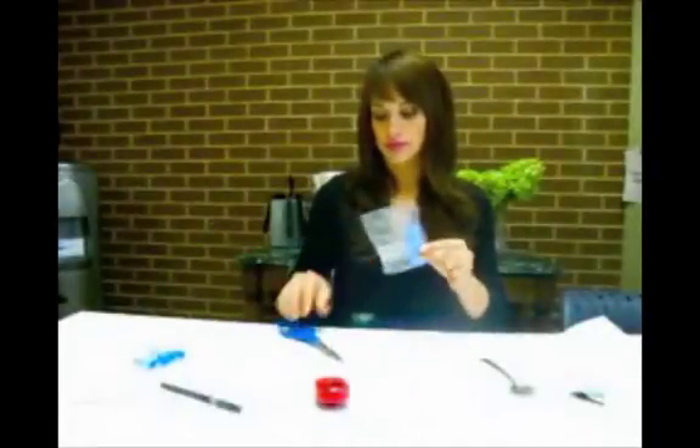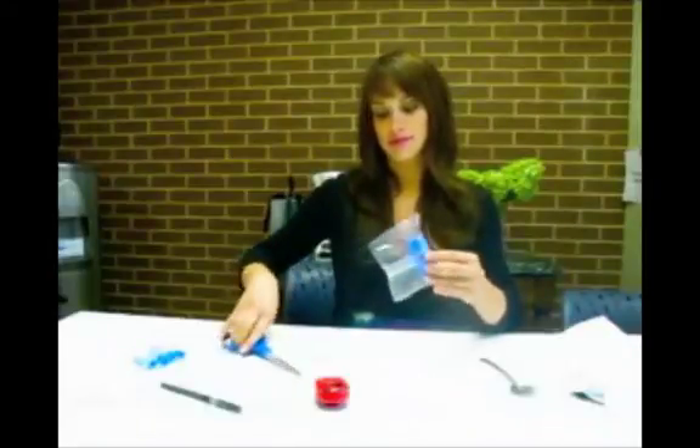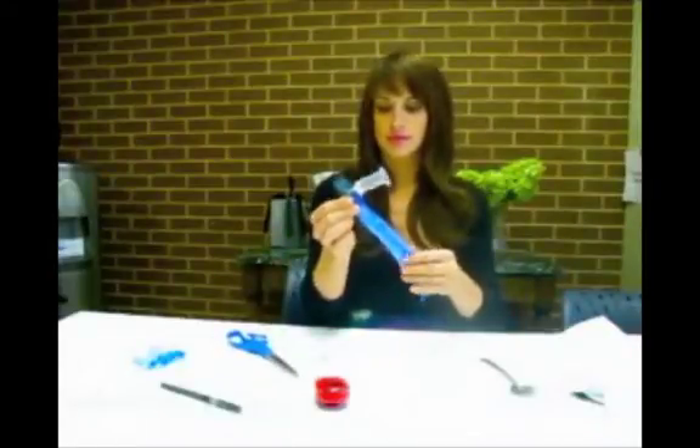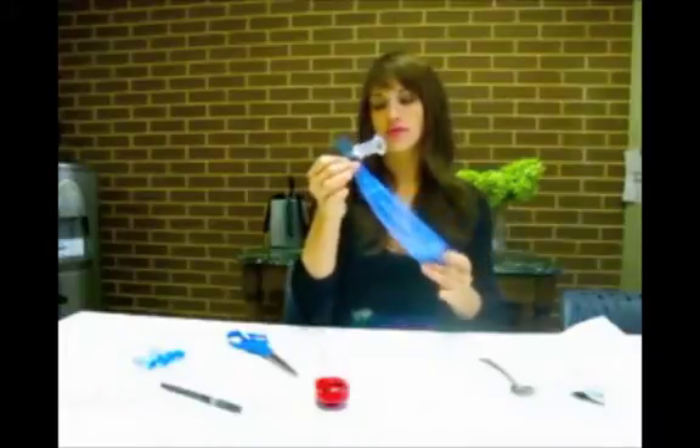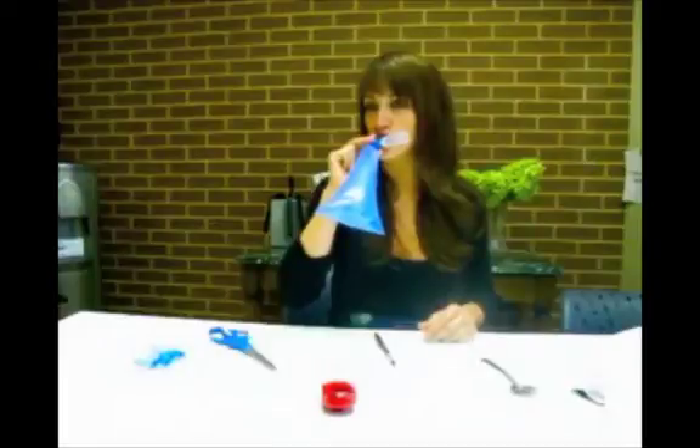Carefully cut open the bag containing the easy sampler device. This has a blue bag attached to the blue mouthpiece and a white tube where we will insert the test tubes later on. Do not put your finger inside the white tube. Practice blowing into the tube and inflating the bag. The air will escape through the vent at the end — this is normal.